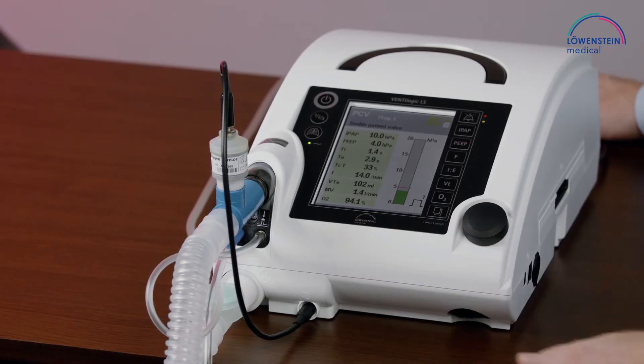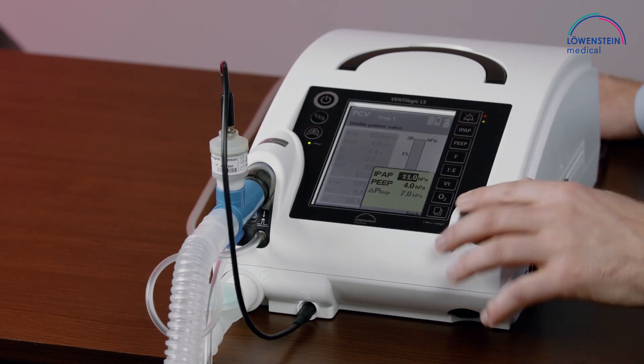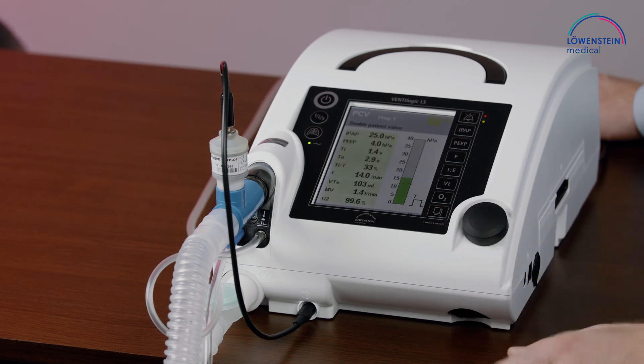We will see the FiO2 at a very low pressure level, and after that I will increase the IPAP to a normal level, or to a much higher level of 25 hectopascal, and we will see the resulting FiO2. It's 99% and still increasing, but I will now increase the IPAP to 25. Much higher pressure — and the FiO2 will drop to about 70%.